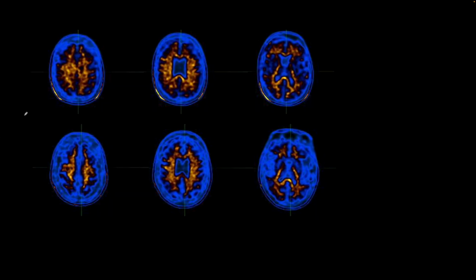Here is another example where on the top we have axial images showing high plaque burden, and at the bottom we have images showing improvement in amyloid plaque burden post-treatment on amyloid PET scans.